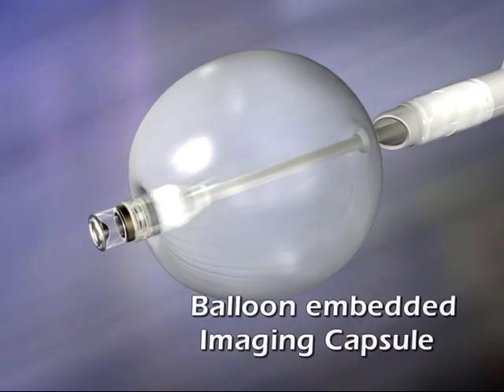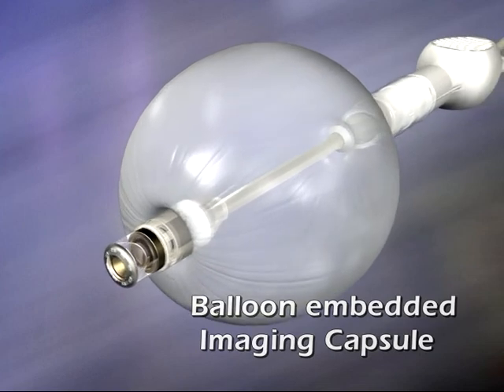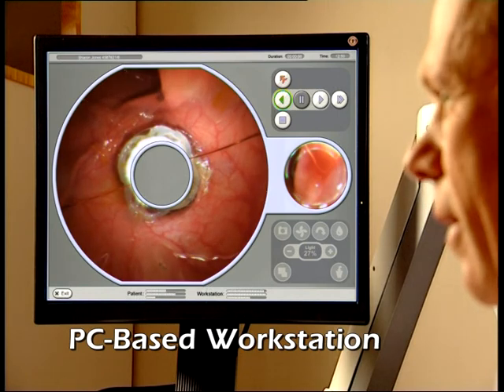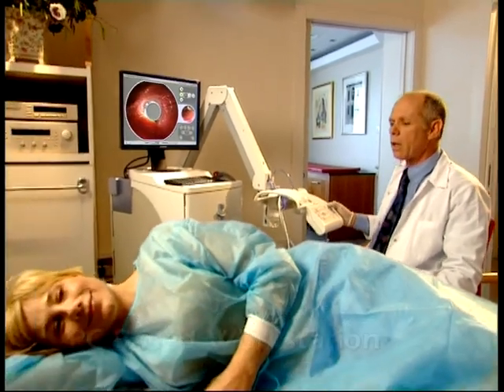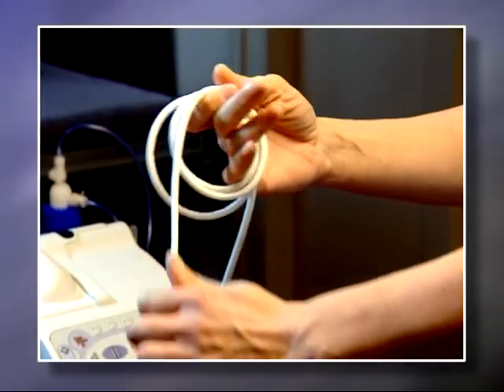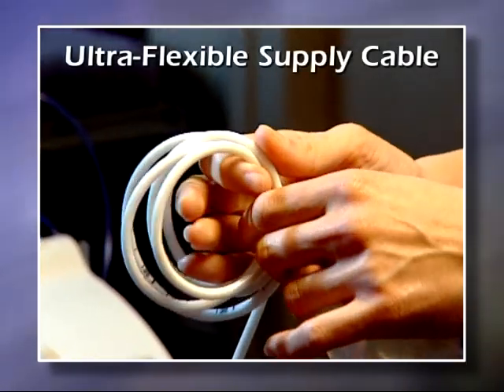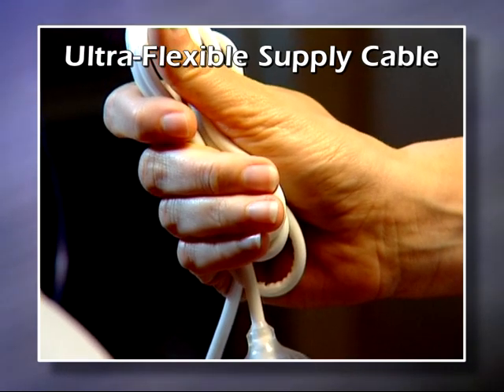The Aeroscope system consists of an advanced imaging capsule mounted on a balloon, and a PC-based workstation through which the physician controls and monitors the motion of the Aeroscope device during the examination. The imaging capsule and balloon are connected to the workstation via an ultra-flexible, multi-luminal cable that supplies Aeroscope with air, water, suction and low-voltage current.